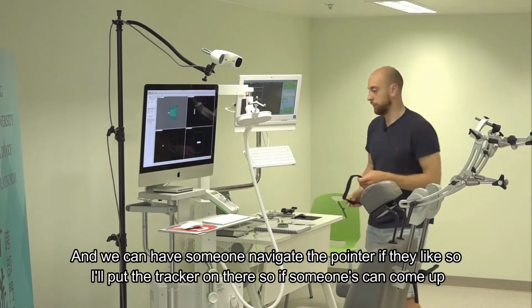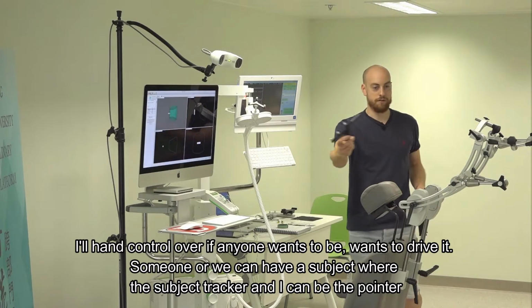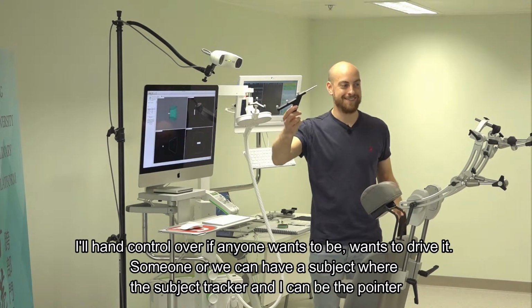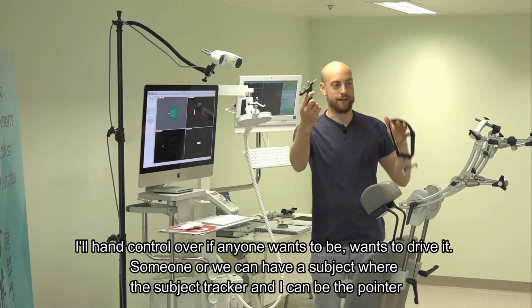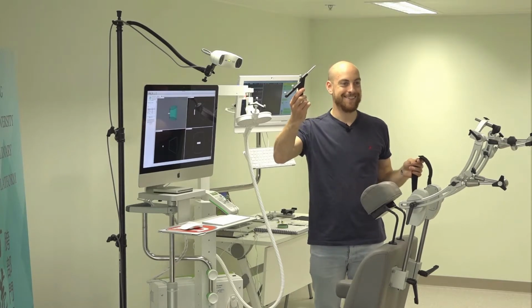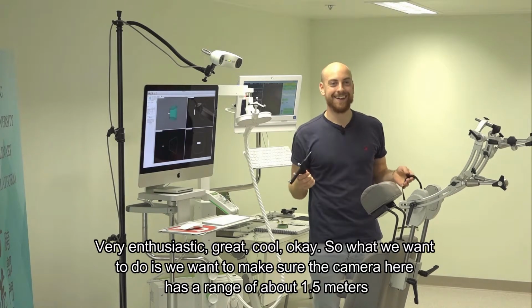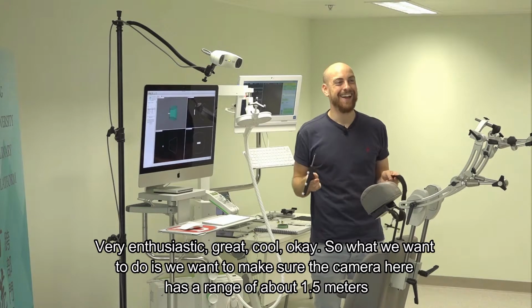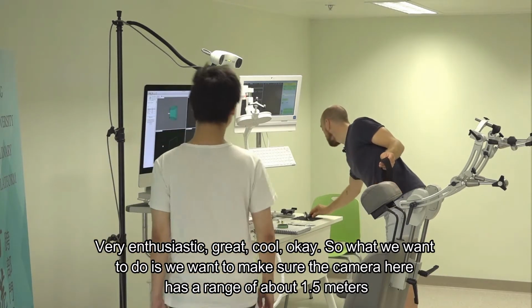I'll put the tracker on there. If someone wants to come up, I'll hand control over if anyone wants to drive it. Someone? Or we can have a subject where the subject tracker, and I can be the pointer. Very enthusiastic. Great, cool. Okay.